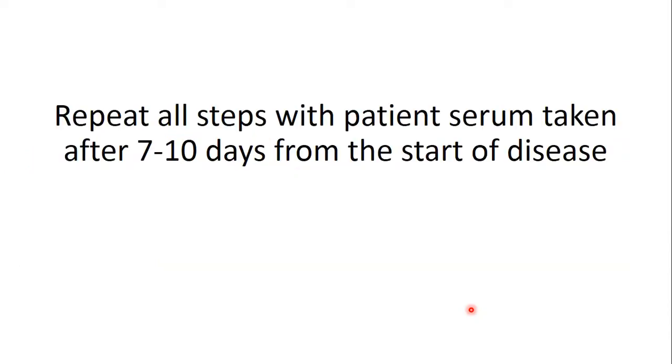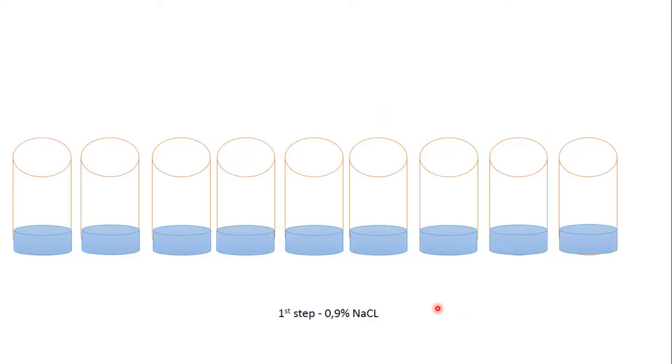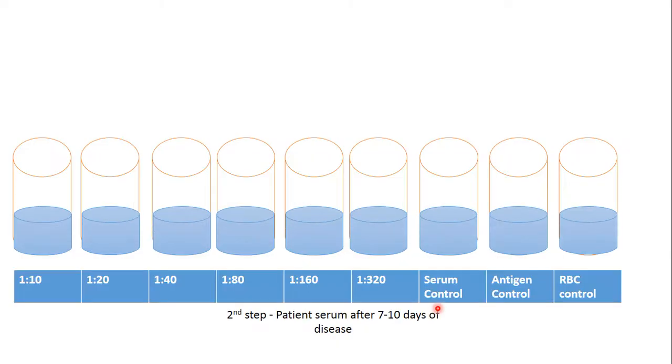Repeat all steps with patient serum taken after 7 or 10 days from the start of the disease. Add physiological solution, then dilute the patient serum taken after 7 or 10 days. Third step: add viral antigen to the test tubes.